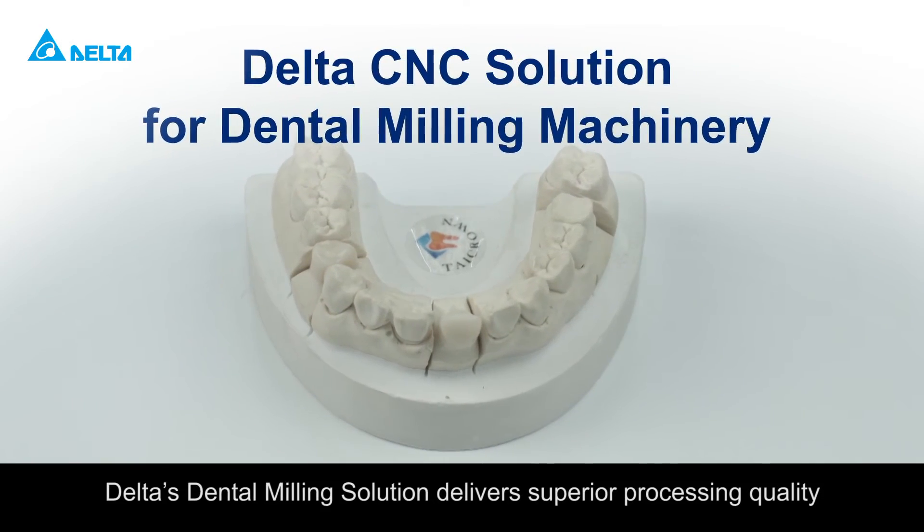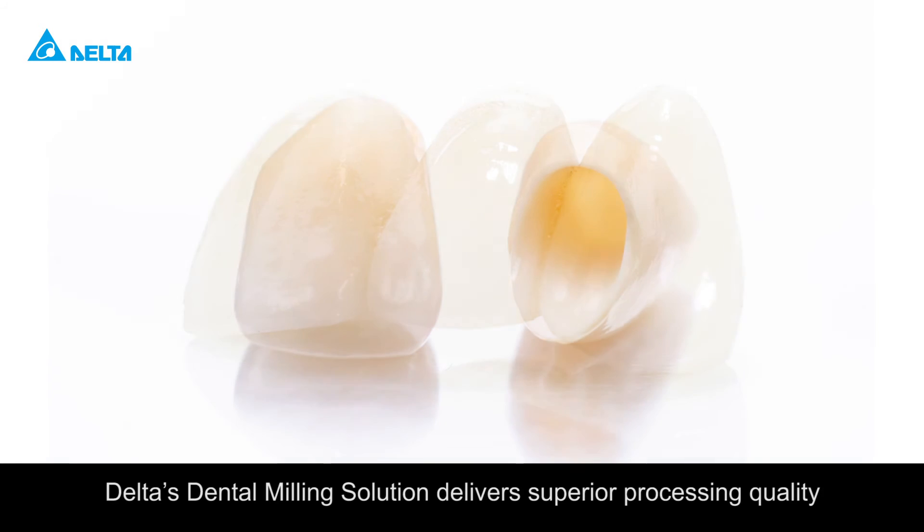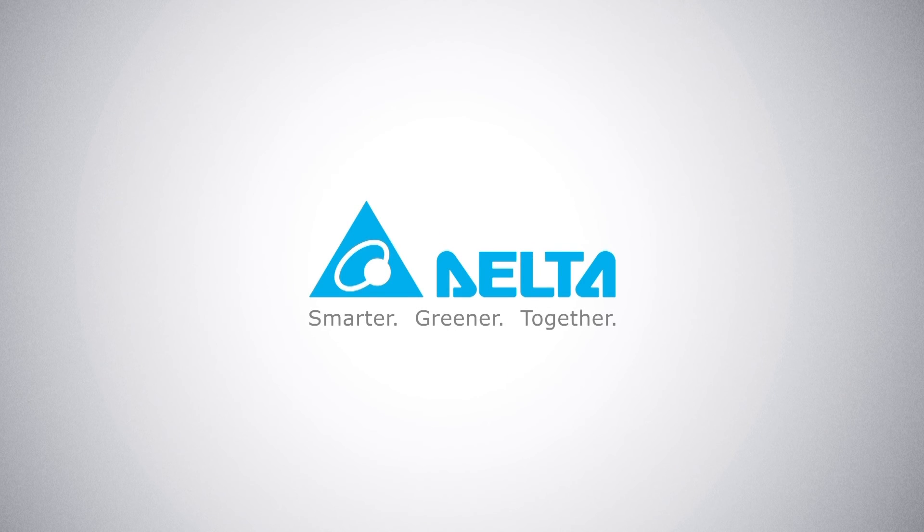Delta's Dental Milling Solution delivers superior processing quality. Your best CNC choice.